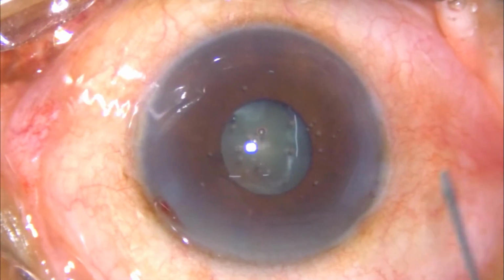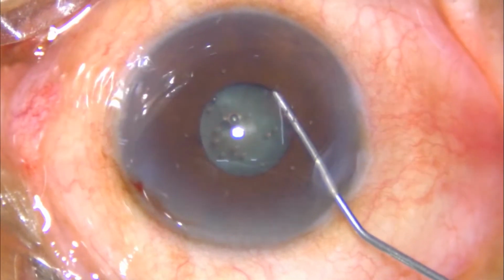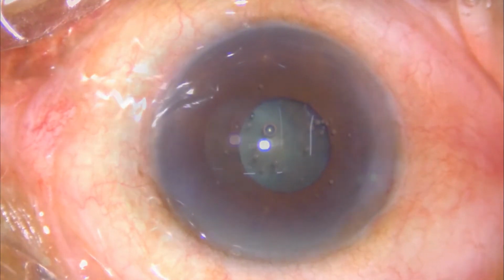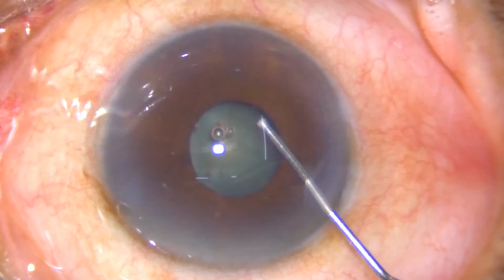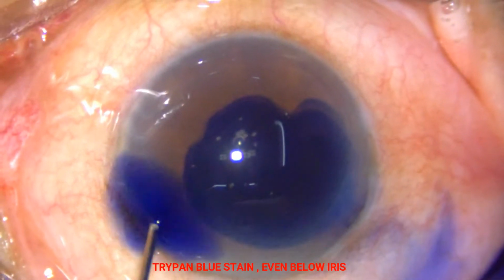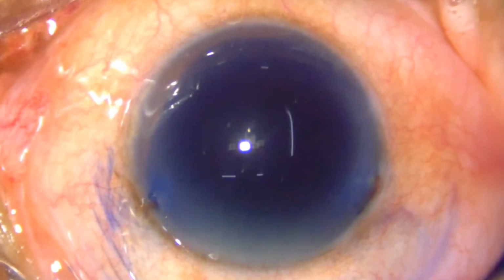Do watch every step of your surgery, right from incisions, the drugs used, pre-operative and intraoperative drugs, the type of viscoelastic material, and try to handle tissue very carefully. Here I have tried using intracameral adrenaline. Staining of the anterior capsule is very important.